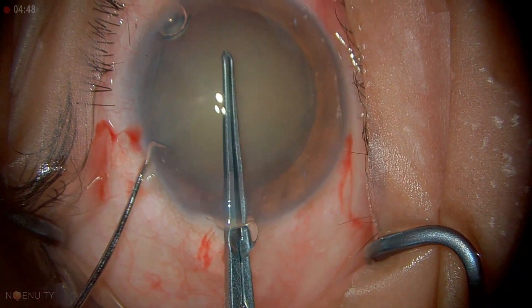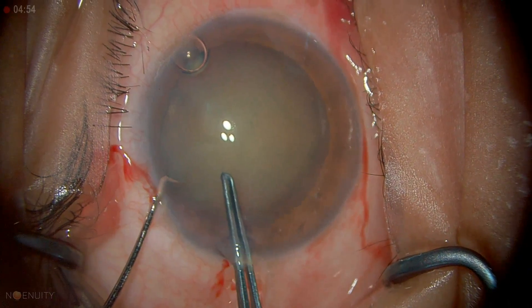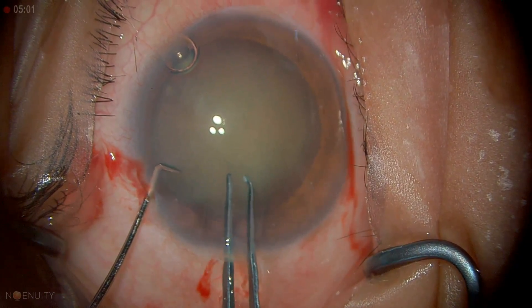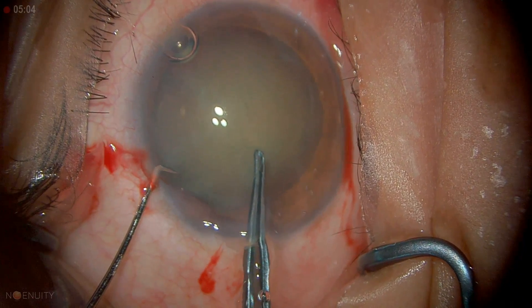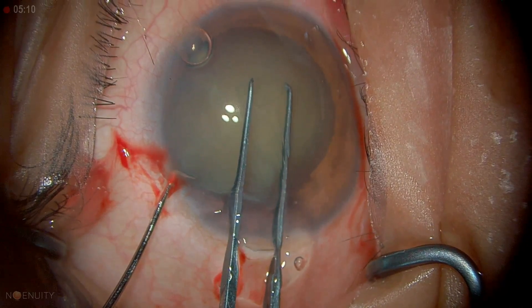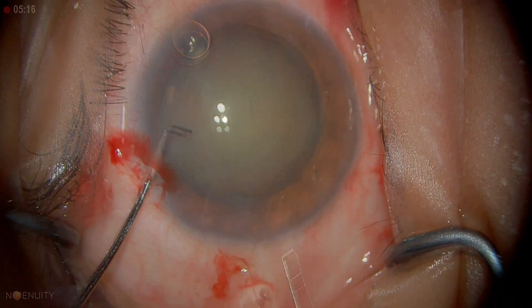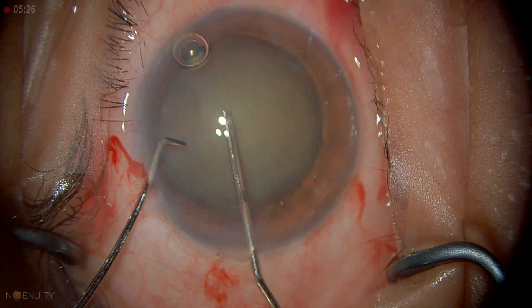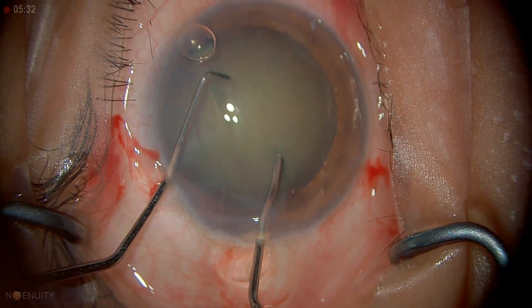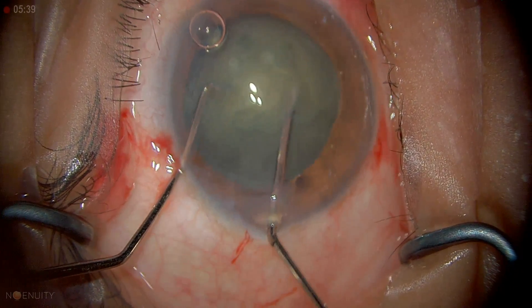Having the second instrument in enables me to control the position of the eye. I've initiated the rhexis axis and I'm going round slowly, trying to get a nice round rhexis. That's the completion of the rhexis. And this is the hydrodissection. This is about the outside limit of where I would be able to do the rhexis without staining, because there is really no good red reflex.